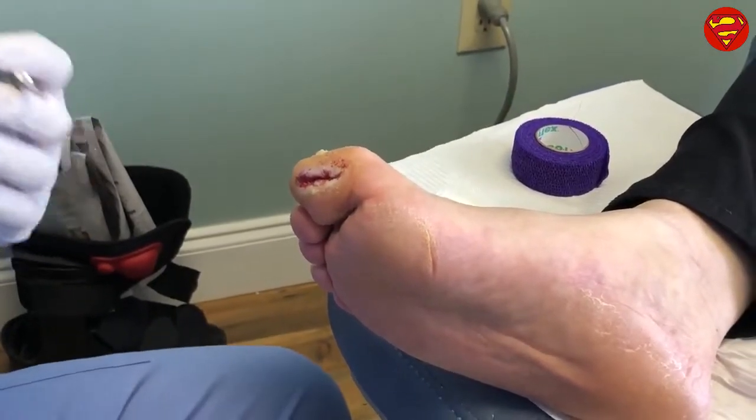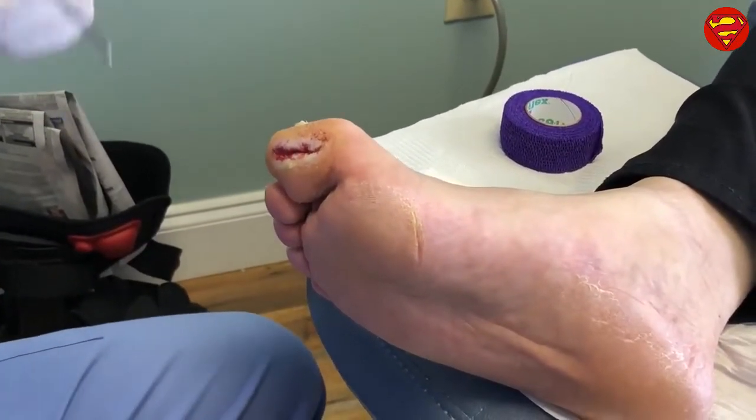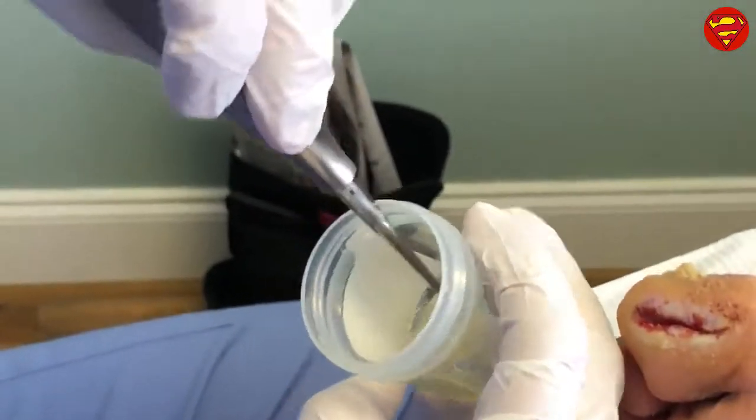You've seen in the past we do PRP injections for Achilles tendonitis, plantar fasciitis, or any type of tendonitis. So today what we actually do is the same concept — we draw the patient's blood, we spin it down, and then we actually combine it with thrombin, which forms this clot.